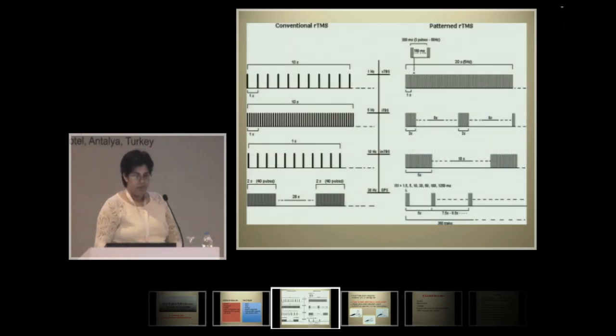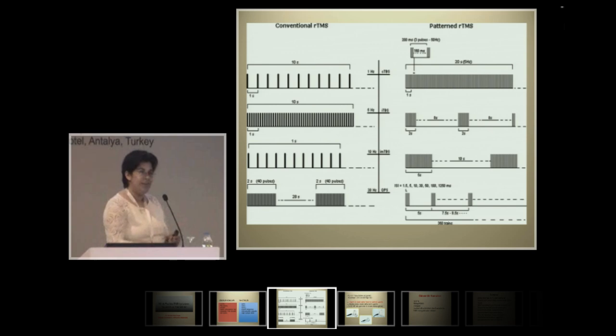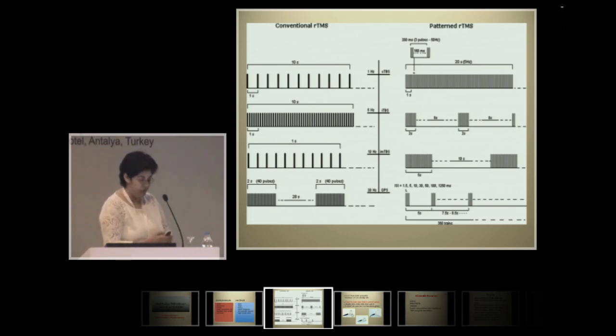I only want to show you one single technical slide because everyone who is using TMS will have a clear idea about its mode of action, but for the non-users, this will provide an insight about the mechanism of action. There's only a clicking sound that comes from the machine, and they talk about certain protocols. What are these protocols? What is 5 Hertz? What is 20 or 25 Hertz?